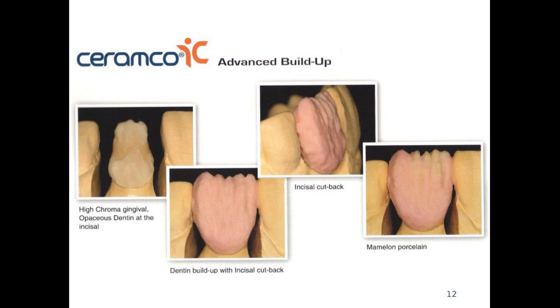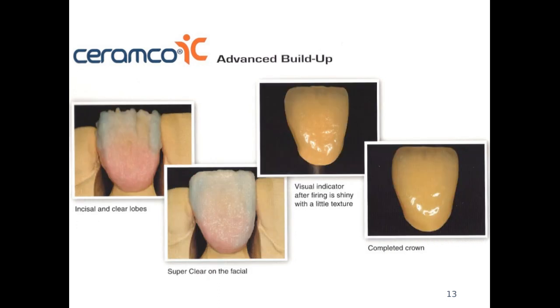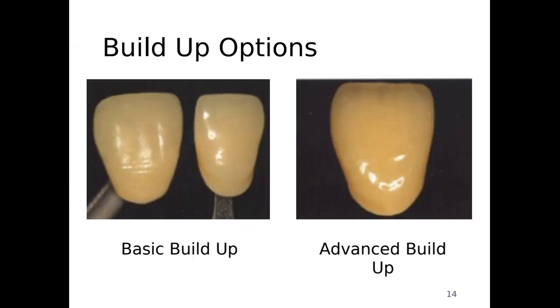Every time we use a new porcelain, we have to look at the manufacturing instructions for baking temperatures and programs. We can also add porcelains that are more translucent to create that translucency. They are applied only in certain spots on the crown — we have to make sure we know exactly where they go and not put them all over. Keep in mind that every time we bake the porcelain, the porcelain shrinks.